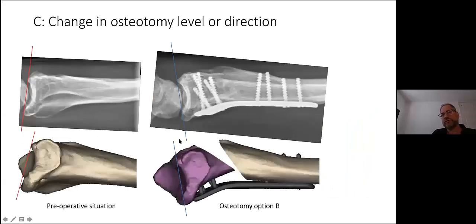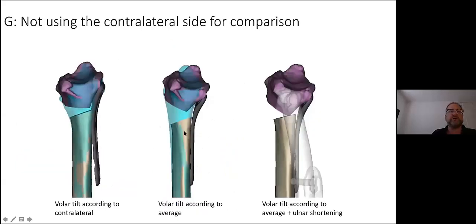You can also choose a different kind of osteotomy. You can do it straight like this, perpendicular, or to get a smoother surface here to save the tendons on the backside, you can choose to do it differently. So you can manipulate and try. Here you had also the plate lifts a bit from the bone. And again, you have this large gap. So we shortened the other bone, and then we had some contact here, and we made a little bit of bending on the plate as well, I think.